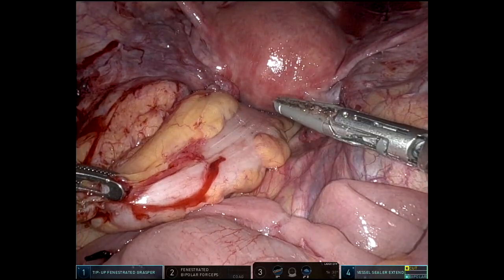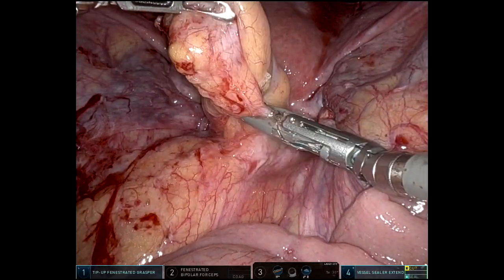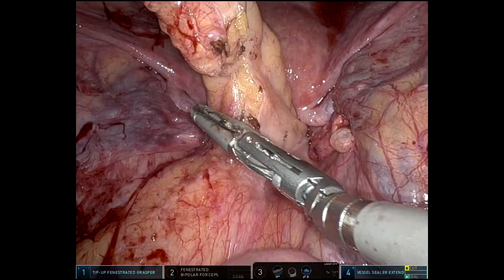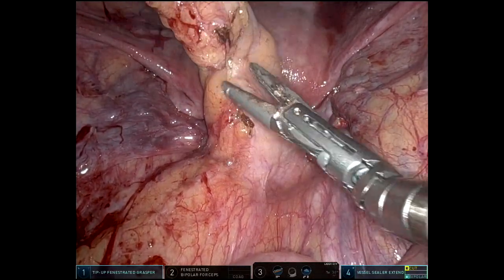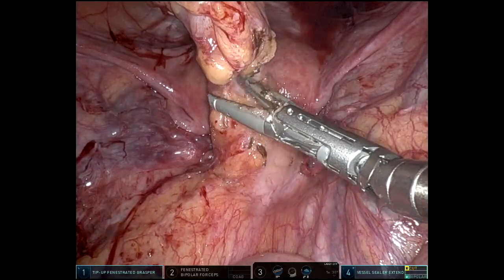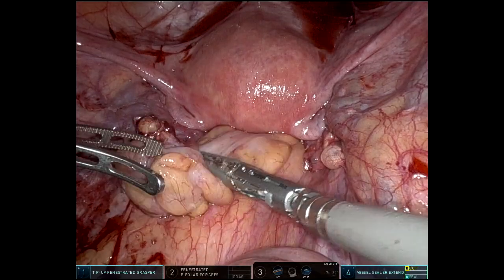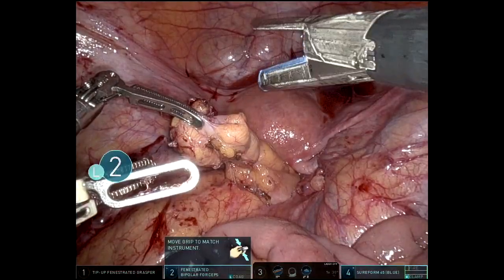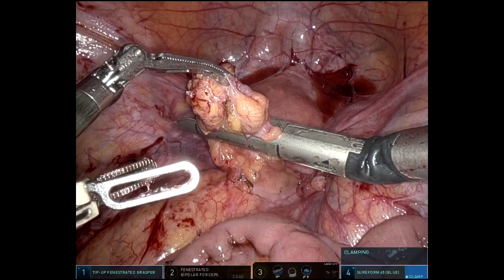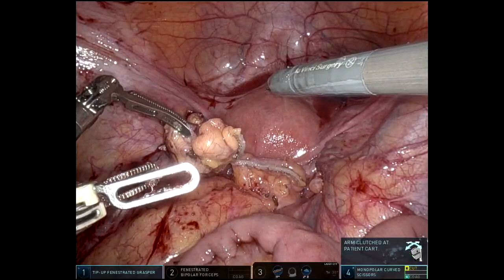Now you're going to get a look at her rectal stump. There was a bit of sigmoid colon left on this — it was so nice and mobile, which made the additional sigmoid resection very easy. I find you always have to take off some of the top of the rectal stump because of how scarred it gets. It's just not compliant enough to easily pass the stapler up there, or even if you're doing a hand-sewn anastomosis. Probably everybody takes off a little additional rectal stump here — and that was nice and easy.